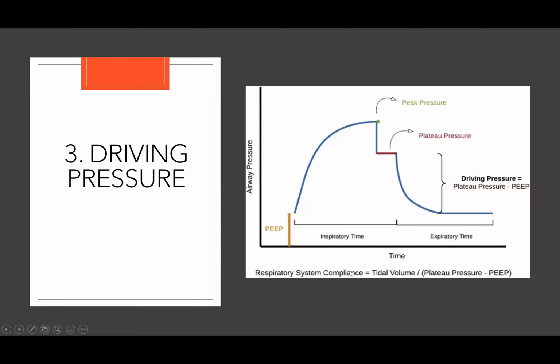So the third variable here, and this is a pressure time curve for a volume control breath, which many of you have seen, so I'll rip through it, but we have an increase in pressure as we deliver the volume up to some peak. The air that goes in this phase has to overcome the resistance of the tube and the bronchi. We can then hold the inspiratory limb and close the expiratory valve so the pressure will decrease.